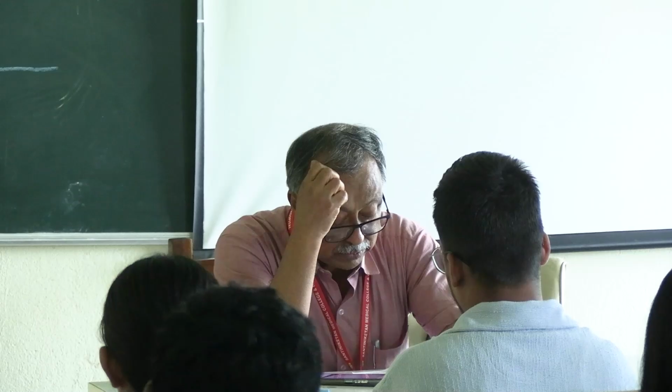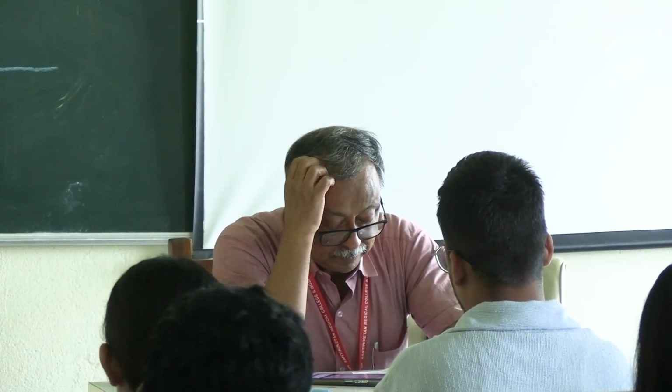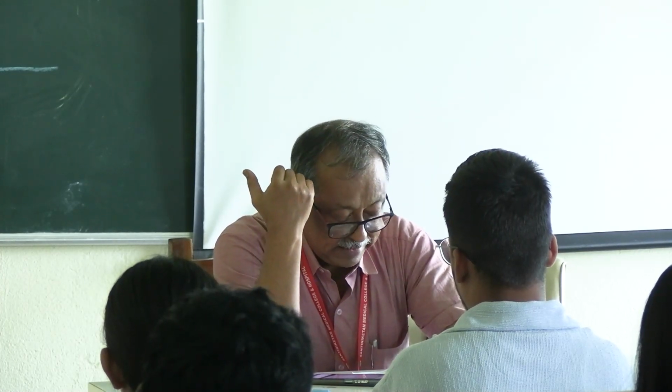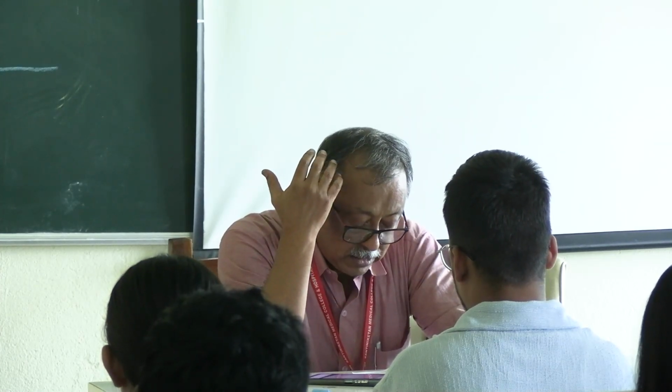Conductive hearing loss: it is equal for the examiner and the patient. Sensorineural hearing loss: it is longer for the doctor, if it is a normal hearing doctor.